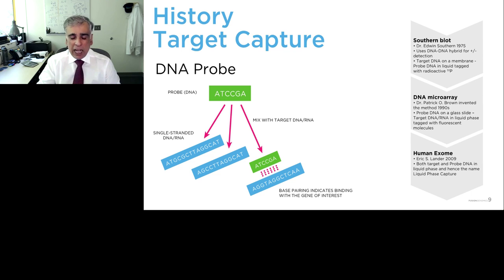And then you will add your probe, or your complementary oligonucleotide, to go and bind it. When it moved from that into DNA microarrays, the nitrocellulose or nylon membrane was replaced by a glass slide, on which your oligonucleotide probes were placed. Then you would add your interrogating DNA or RNA onto it and see if it would bind. You would have a fluorescent signal.